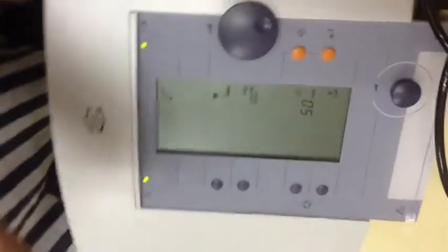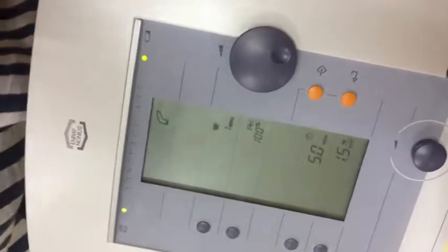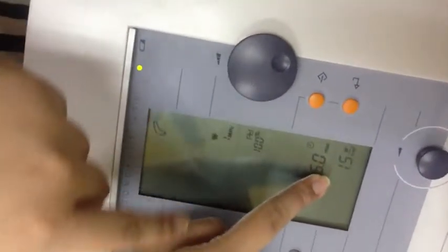Anong pinagkaiba ng watts lang sa watts per cm squared? Pag watts per cm squared yung ginagamit natin, kino-consider natin yung laki ng area na tinitreat natin. So, that means na kada isang square centimeter of the area being treated, 1.5 watts yung nabibigay doon. Unlike, for example, kanina, in-adjust natin siya sa watts, ang counterpart niya is 7.5.